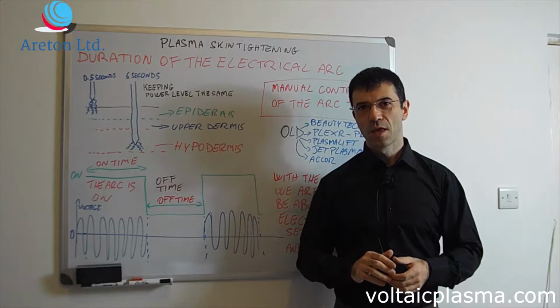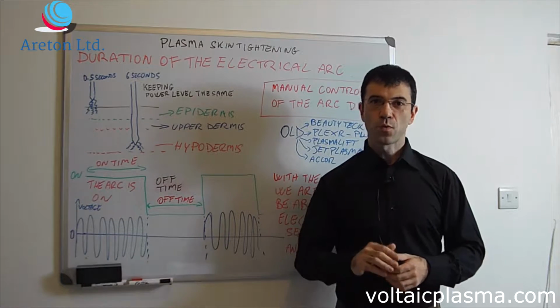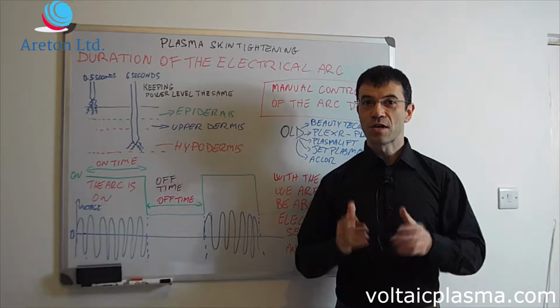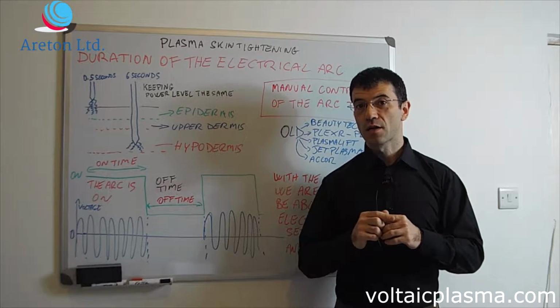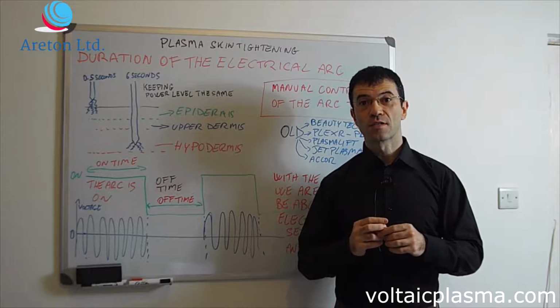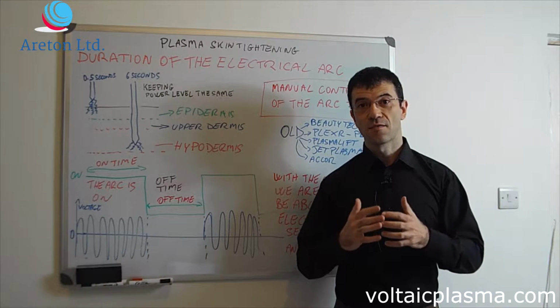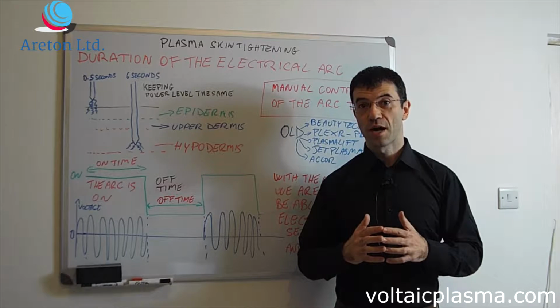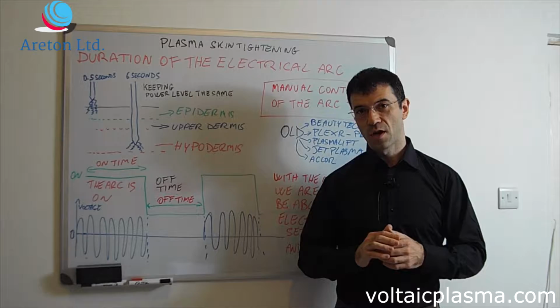In this video, we're going to talk about two very important points. The first one is the skin ablation and its relation with the duration of the arc. And the second point is what we're going to do about it in the next devices that we're going to put onto the market. Now, the first point is the duration of the arc.